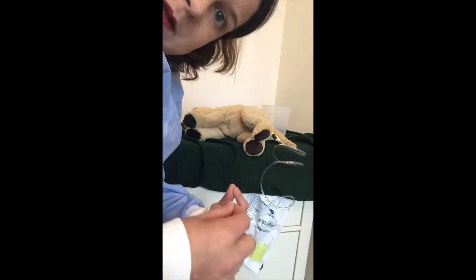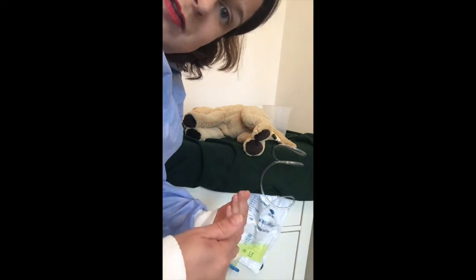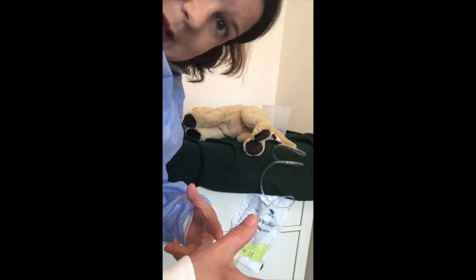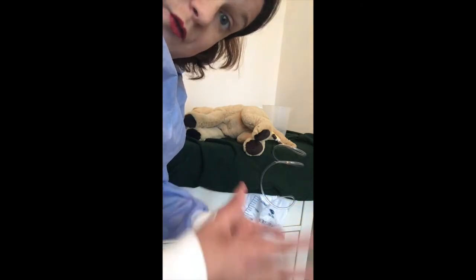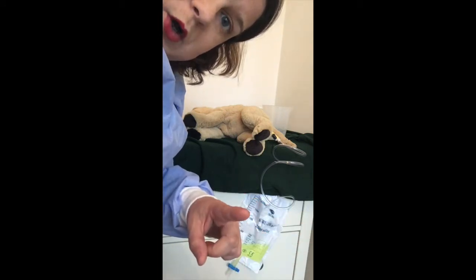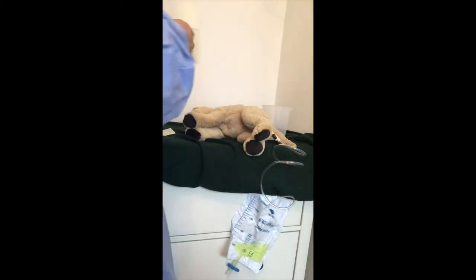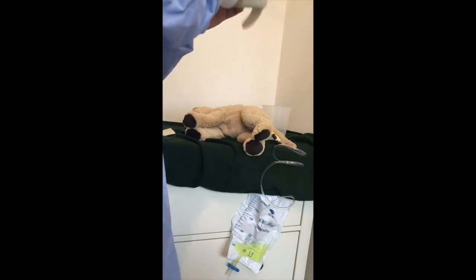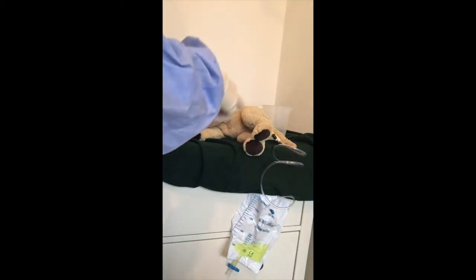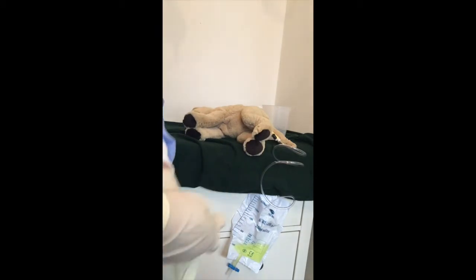You'll also do a WHO hand wash at some point in this task. Beginning or end — the choice is really yours, because it doesn't say that you're clean when you go in or that you've been contaminated on the way out. So if you're worried, do it first to get it out of the way. We've got a WHO Hand Wash video already done. I'm going to pop gloves on because I am going to be touching the bag.